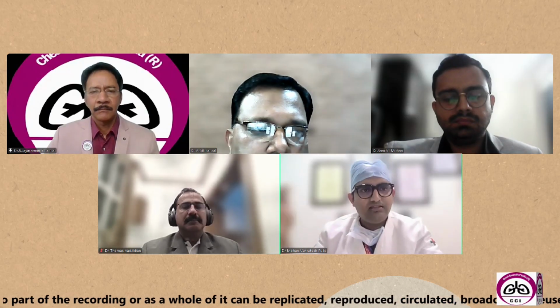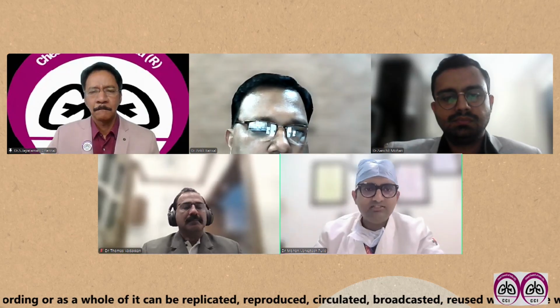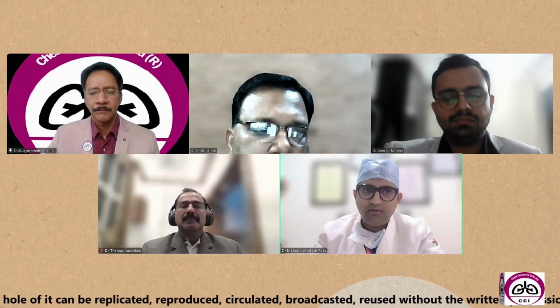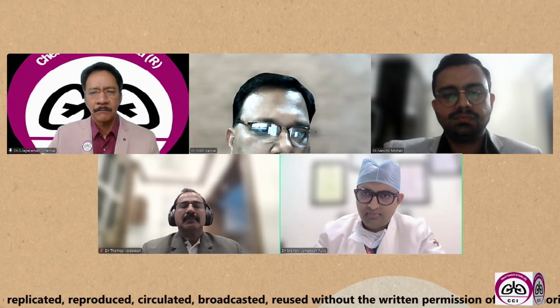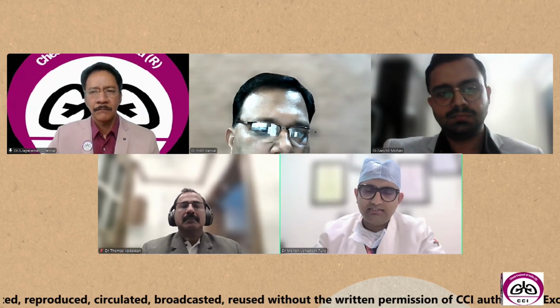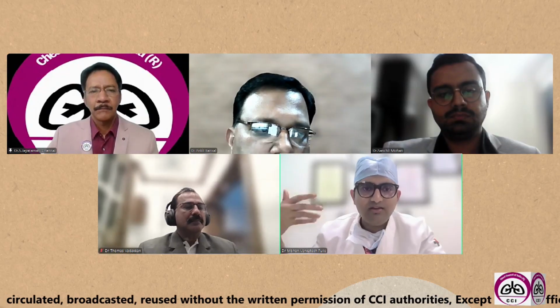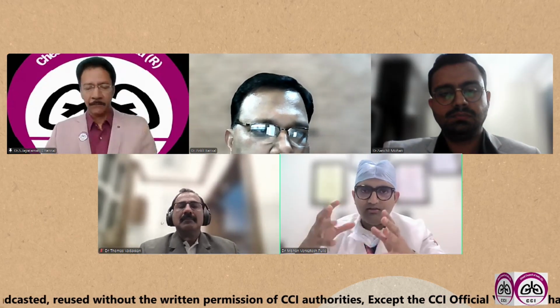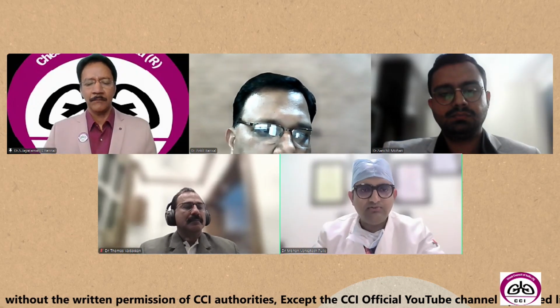But after a few years, EBUS will be the only way. There will be no need to do it, even if the EBUS comes negative, you can comfortably take it as confirmatory without the need to do mediastinoscopy and prove it negative, because the techniques of EBUS are so good that the negative predictive value and the sensitivity are very high.